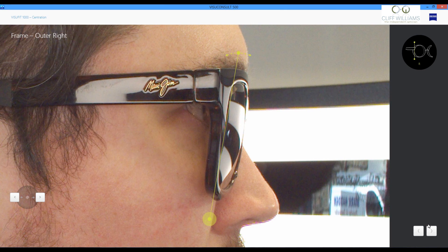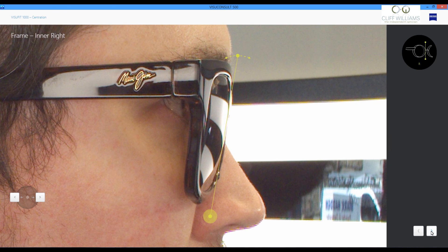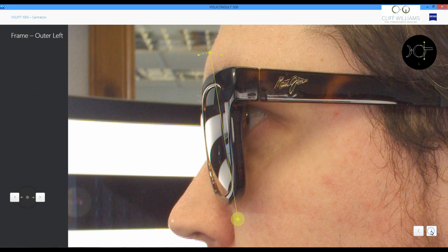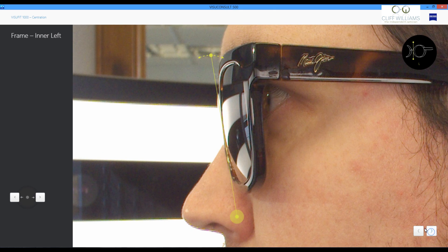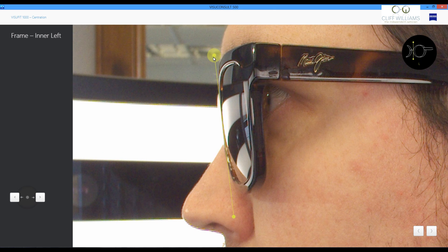We then want to get the angle of the sunglass in towards the cheek. At both the temple and also the nose. This allows us to work with higher curvature lenses and reduce peripheral distortion using Zeiss sunglass lenses.